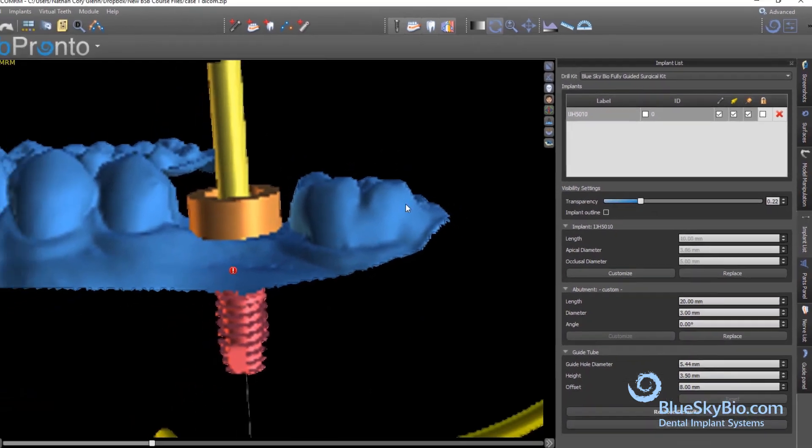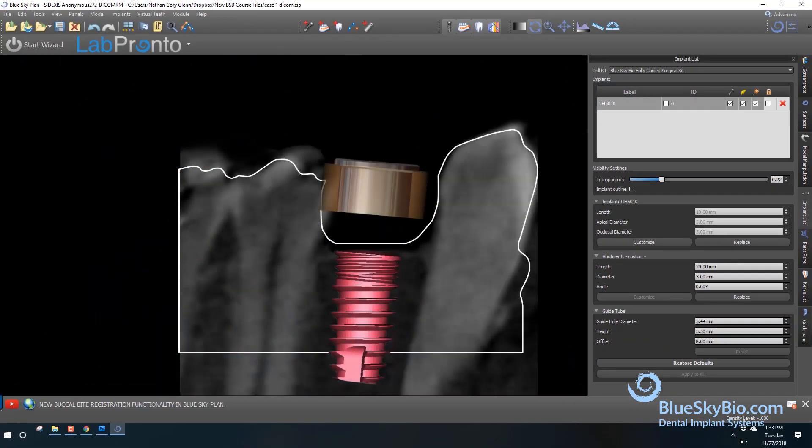The printed hole in the surgical guide, represented by the Brown Software Guide Tube, is housing the metal cylinder in the surgical guide. The hole has the correct inner diameter and is automatically positioned to guide the drill to the correct position and to stop the drill at the correct depth.